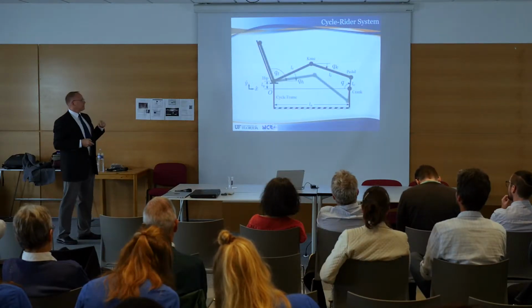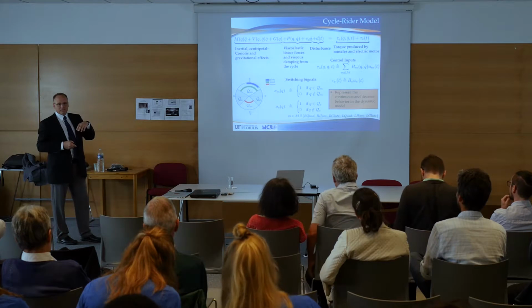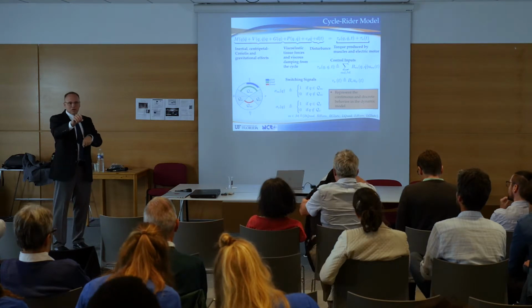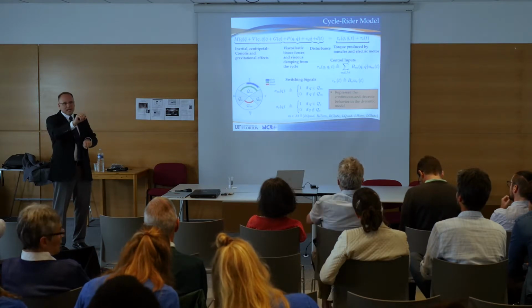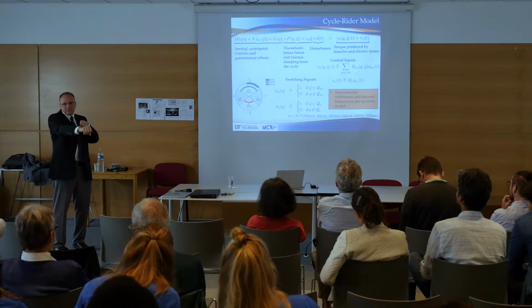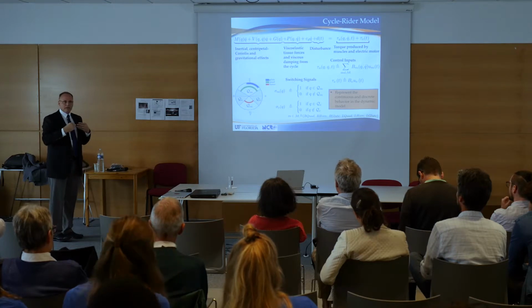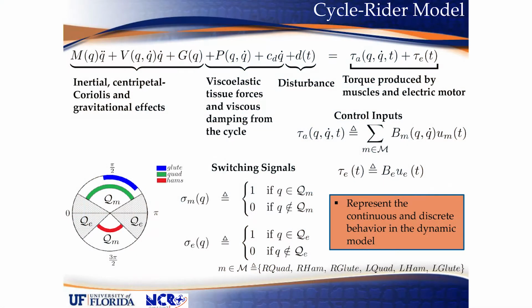And from a control theory perspective, this causes some complications because there are periods in the crank cycle where you don't have any control authority. You're just not stimulating at all. And so an effect of that is that you could just get stuck in that region where you're not stimulating at all, and then your errors become unbounded. So we had to do a lot of work there to ensure stability and robustness by switching through the different muscle groups. And so we broke the crank into these different regions, and then we had a strategy for switching between the different regions.